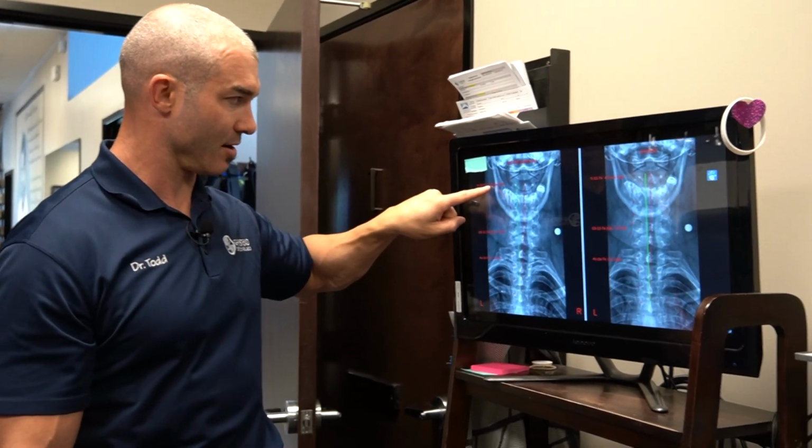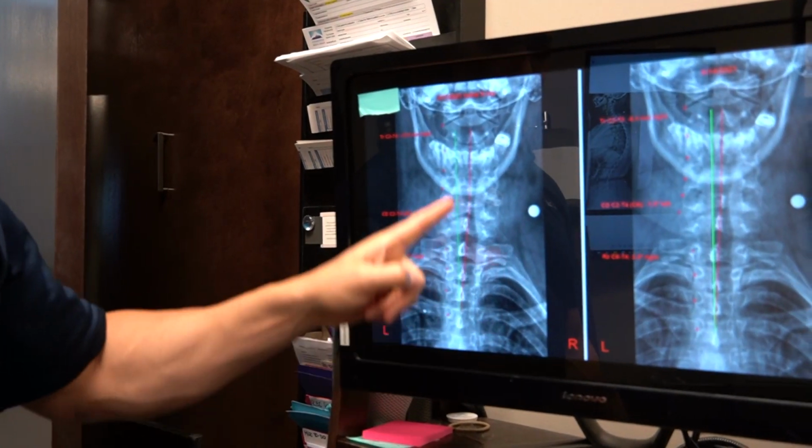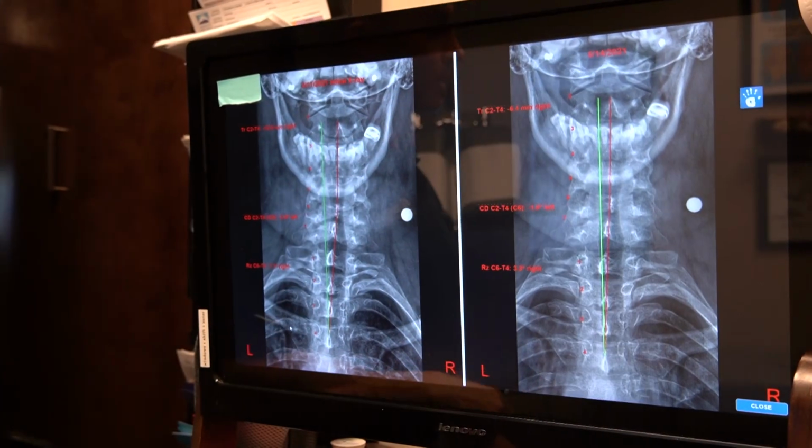And I want to show you a how-to of how we went from this to this. This is measured right here, almost 13 millimeters of offset, as far as where that vertical normal should be, which is measured off of T4, to over here, it went to 6 millimeters. So 13 to 6, that's pretty good. That's more than chopping it in half, right? That's a very good correction.